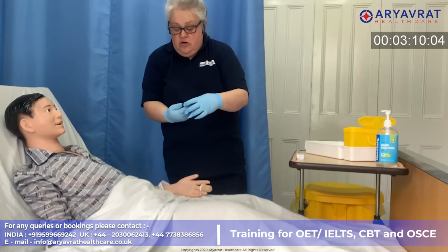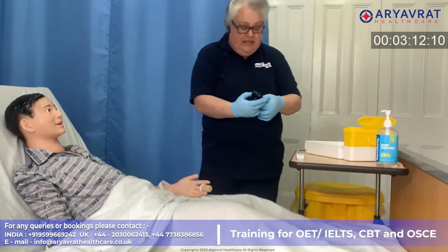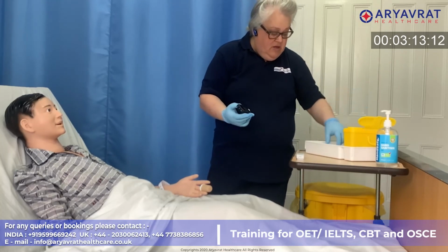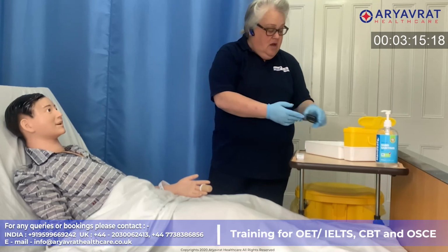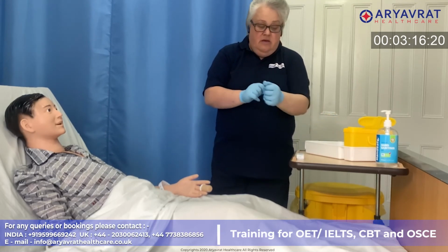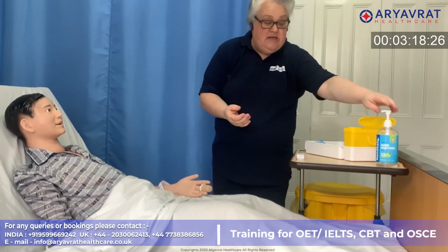And lovely. And here we have a result of 5.2 millimoles. So Ali, your blood sugar at the moment is 5.2 millimoles, which is great. That's perfectly within the normal range. I'm just disposing of that and my lancet into the sharps box there. Okay, I'm going to take my gloves off and do my hand hygiene.